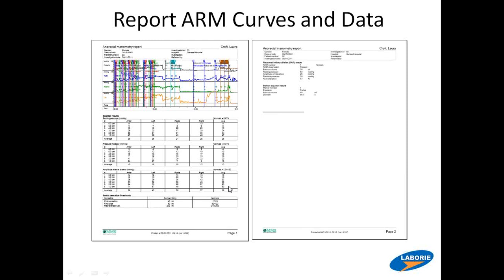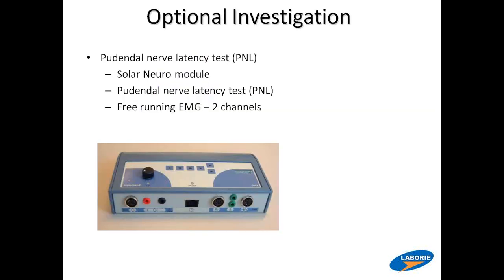And it's not really, interestingly, it says, I think, 63. I can barely see it. The squeeze should be about twice the rest. Here it summarizes the sensations. And here the rectal anal inhibitory reflex and balloon expulsion, if it's present, partial. This says partial, I think. So that might not have been a normal test. But it's very nice to have it all summarized, and you can draw conclusions from that.